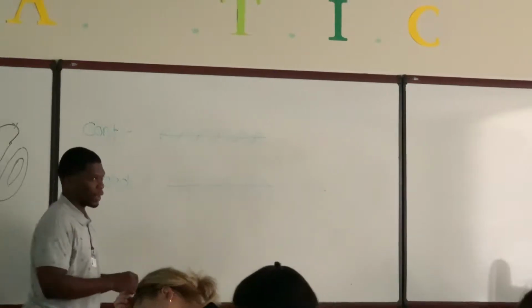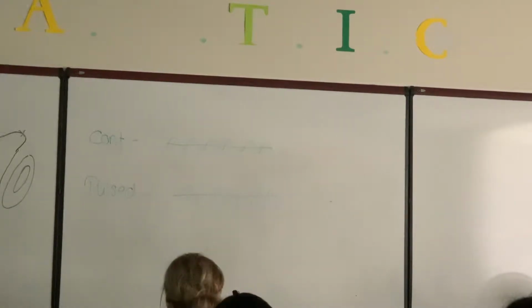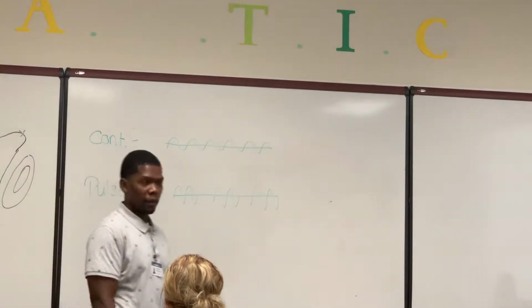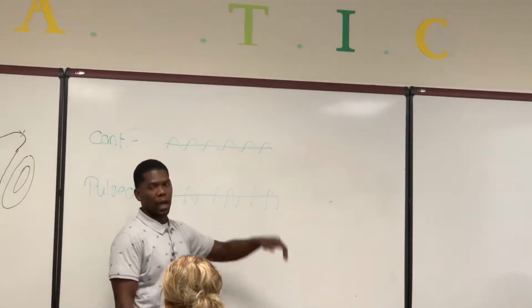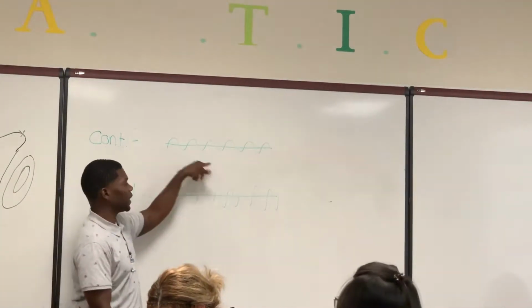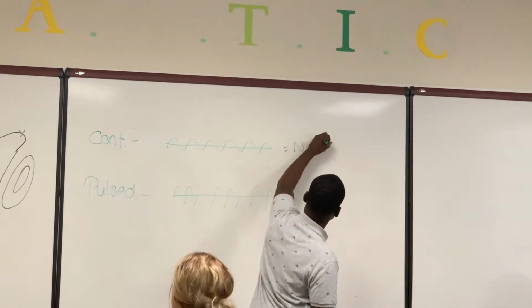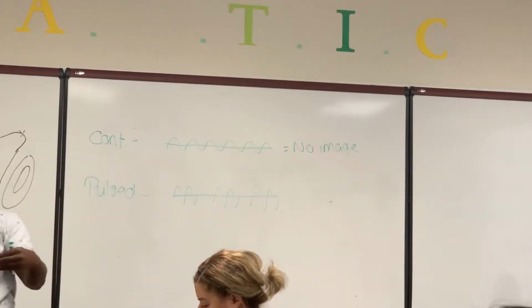So, continuous wave, guys. As you can see, continuous wave, the sound, the transducer. Remember we talked about that last semester. We talked about a continuous wave transducer, also known as what, guys? Y'all remember? A PEDOF probe, right? You see that the sound waves never stop traveling. The language I always use is talking: whenever the sound wave is being produced, it's talking. It's transmitting. So continuous wave never stops, and it's not going to produce an image, because it never gives the transducer time to receive those reflected waves.